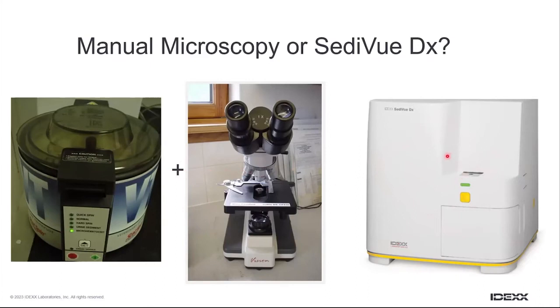It effectively does the centrifugation for you and deposits the cells onto a slide and then takes images of those, and it then uploads those images to the database where you can review those images. So effectively, it's doing the same job as you centrifuging a sample and looking at it under a microscope. So whichever you have, it doesn't really matter. Same rules apply. Rapid analysis and take the results in context with the clinical presentation.